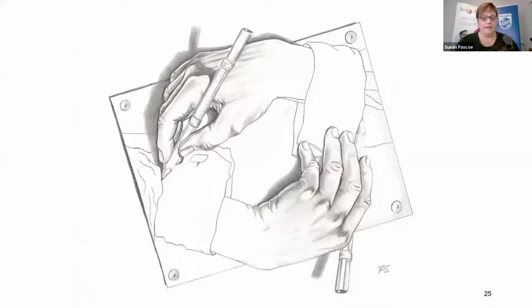The other thing to think about is which hand. You should be putting the needle in with your dominant hand, but often in the scout scan phase you scan with your dominant hand. By the time we get to actually putting the needle in, all you want your non-dominant hand to do is hold everything still. So figure out where everything is and scan with your dominant hand, and then just hold the probe still with your other hand. You need to practice that so that it's not the first time when you get to a patient. I'm pretty cack-handed with my non-dominant hand, and unless you practice it all the time, it's really hard to do the scan well with your non-dominant hand.